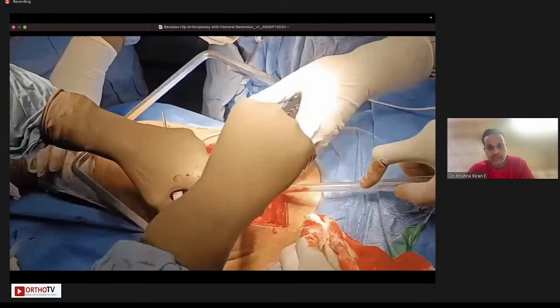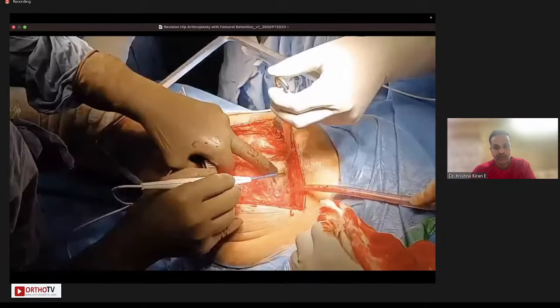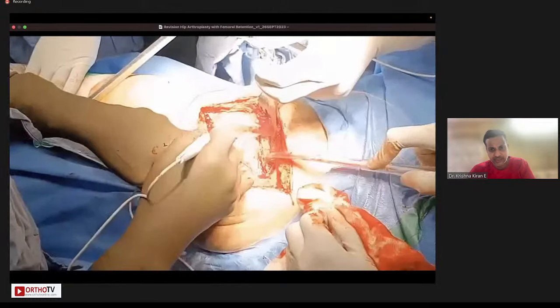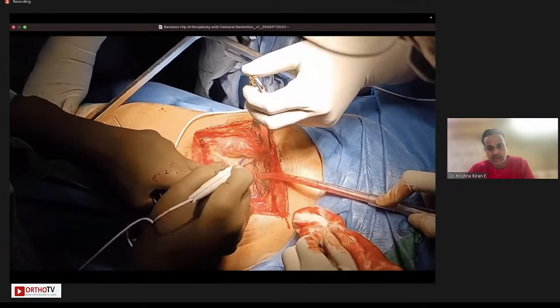And subsequently, you position the anterior retractor underneath the gluteus minimus in order to retract these tissues away. So this gives us reasonable access into the anterior acetabulum. Now you make a radial incision in this scar tissue in the same line and then come down onto the greater trochanter, staying close to the bone.